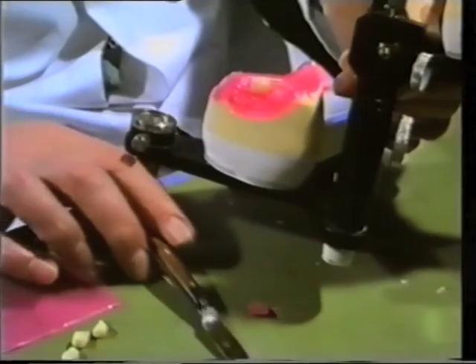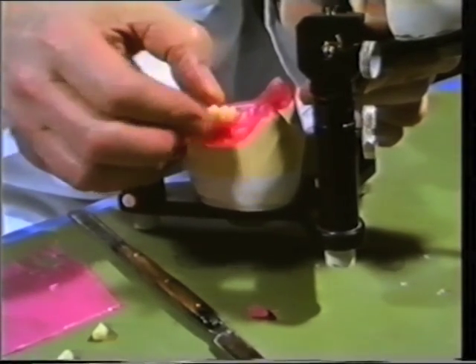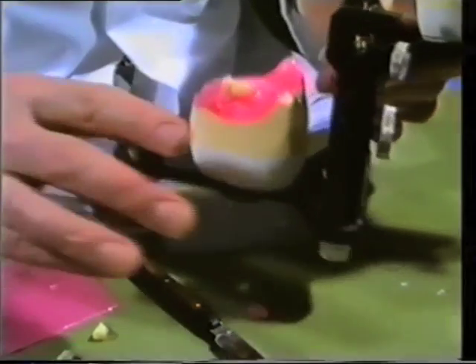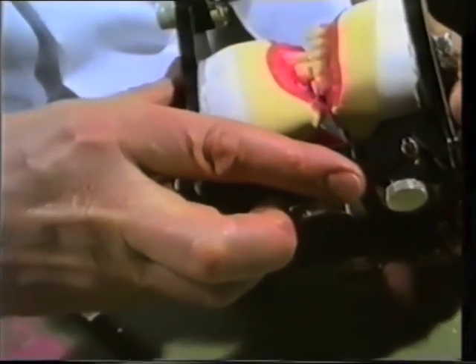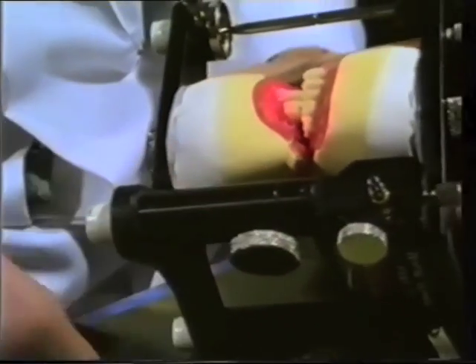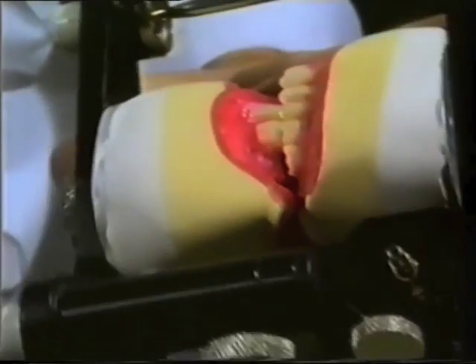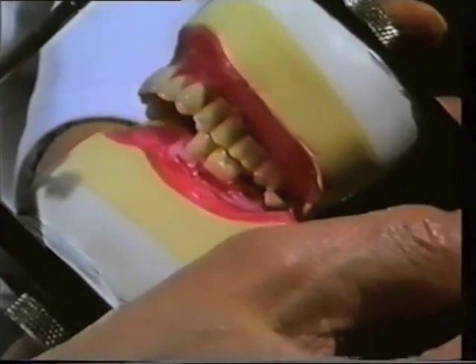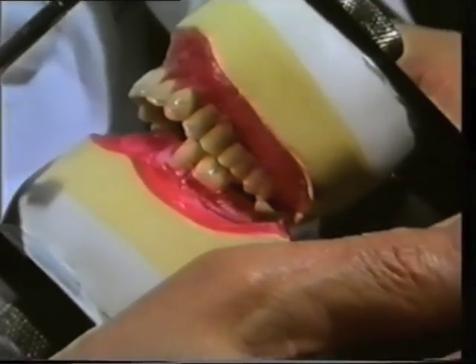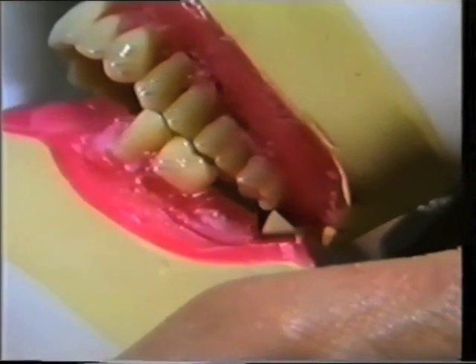The mandibular second premolar is positioned mesially to that of the first molar. An identical procedure is then followed. Again, we see the simulated functional movements being made, resulting in non-working, working, and protrusive contacts.